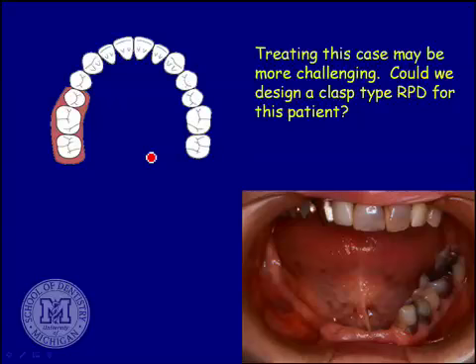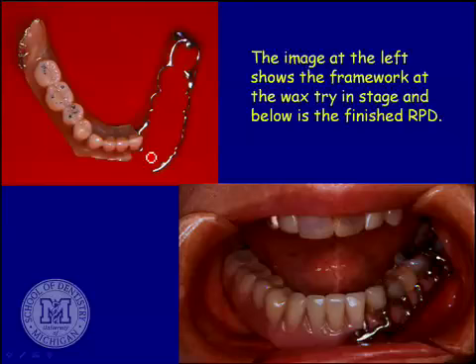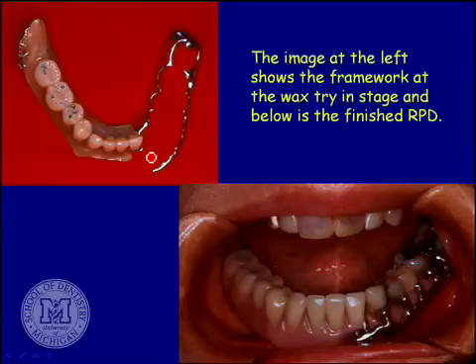These situations might be a little more challenging where you've got all the teeth on one side. Again, this shows a situation where you're trying to clasp those teeth a little more firmly. So you've got these teeth clasped pretty firmly, and this is all replacement teeth. Again, the thing that's now available during your practicing lifetime, what I'd be thinking about rather than making a real expensive framework would be, in a situation like this, over in this area, considering putting 1 or 2 dental implants over there, strategically located. And then you can have a partial denture that would sit in here.